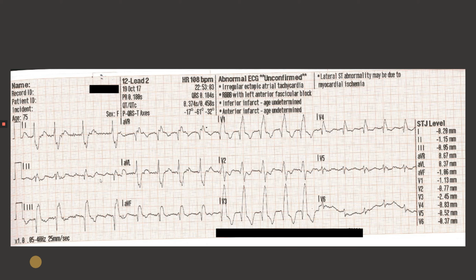All right, so let's take a look at this one. Now, hot mess is what most people think when they look at this, because this has something else we're going to talk about later. For your reference, this has a right bundle branch block, but essentially, long story short, that makes the QRS wide, and it's not ventricular. So if I have a wide QRS and it's not a ventricular rhythm, then it's a bundle branch block. Now, rules still apply here. Okay, I've established the rhythm. We're going to say it's AFib, whatever it is.